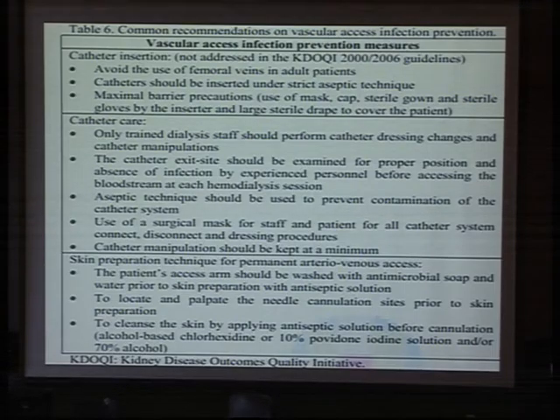What's the recommendation for the vascular access? Starting before the process, during the process, and after that. The most important is to wear the personal protective equipment when starting the catheter process, and also clean the skin very well with antiseptic solution.